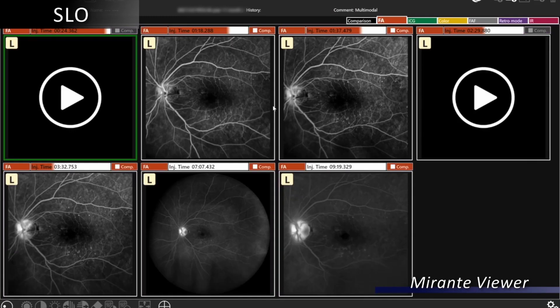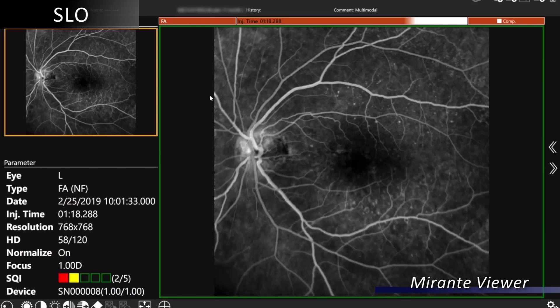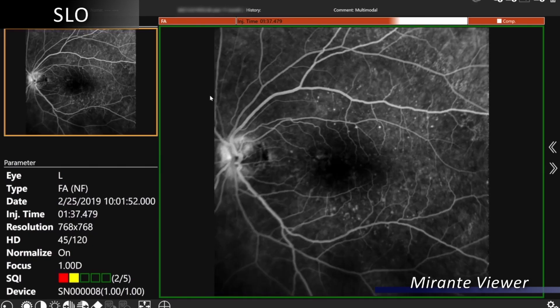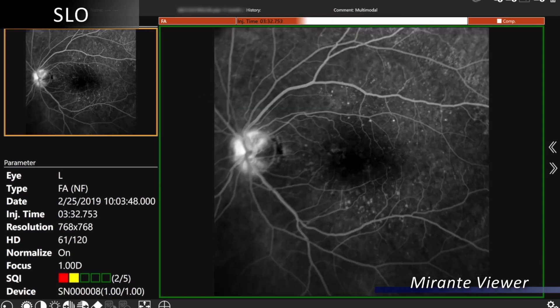On fluorescein angiography, this is a static angiogram, and we can take images of static angiogram images by early phases, mid phases, and late phases.